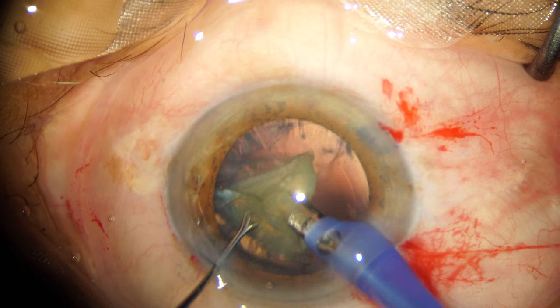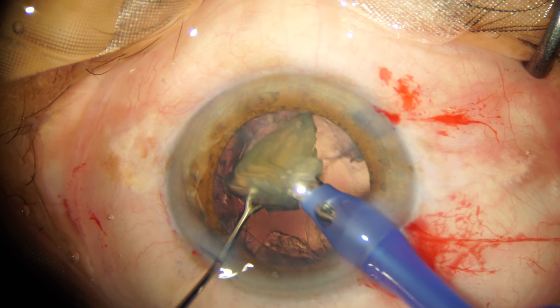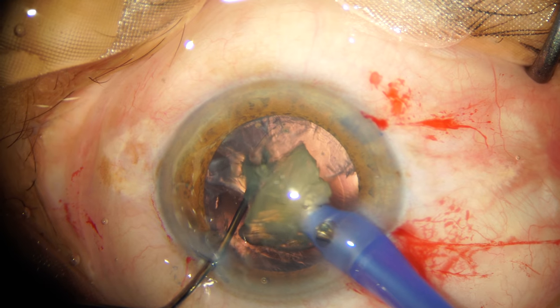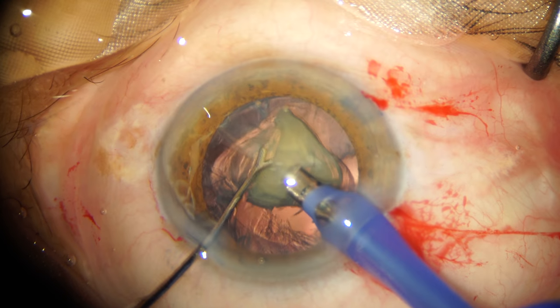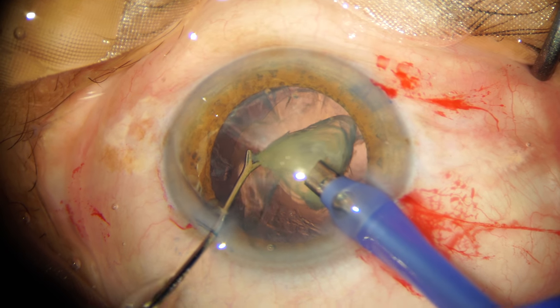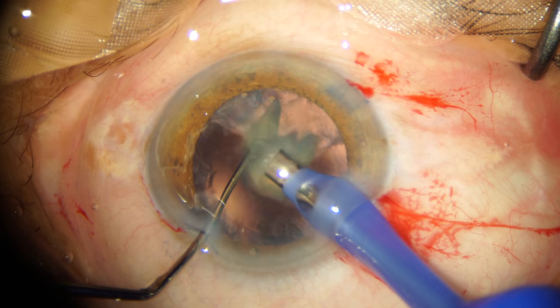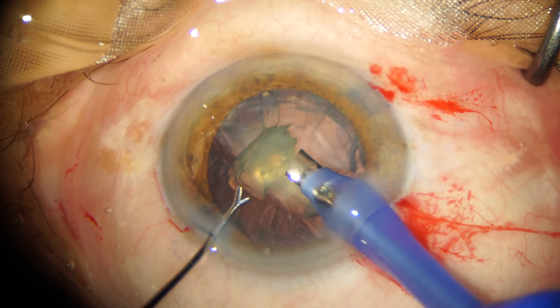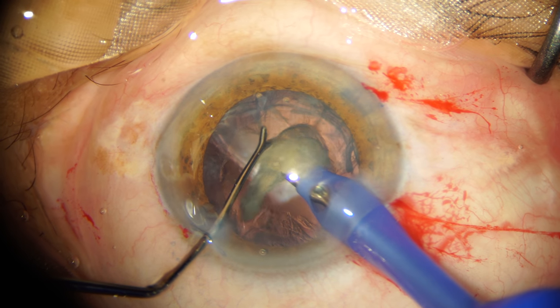This step is especially important when emulsifying the last fragment, particularly for surgeons who don't have high-end machines with very good fluidics. This small preventive measure can prevent surge-induced trampolining of the posterior capsule. Always keep your blunt second instrument behind the last piece when emulsifying the final nuclear fragment in phaco emulsification surgery.